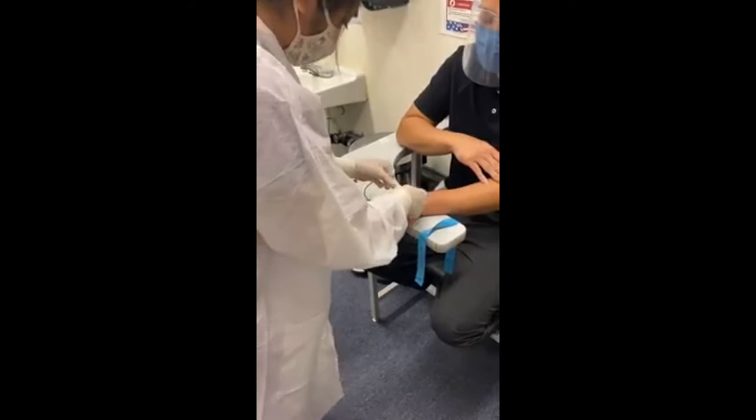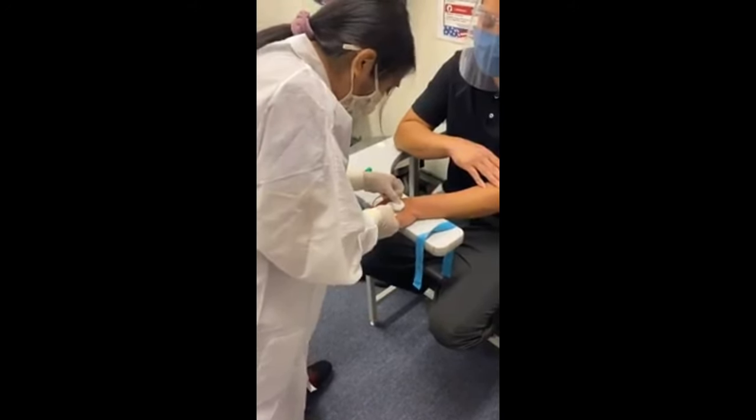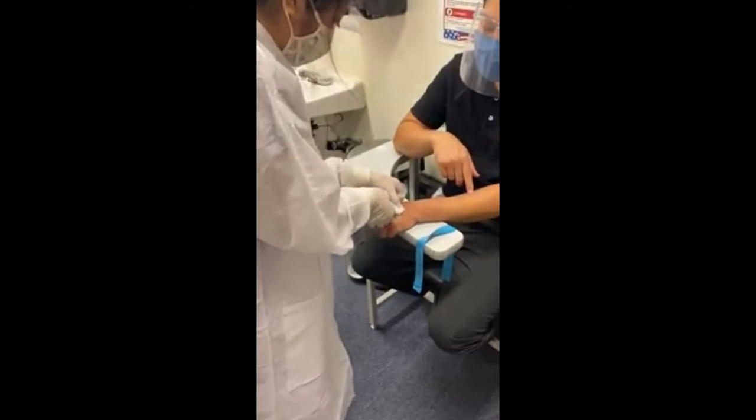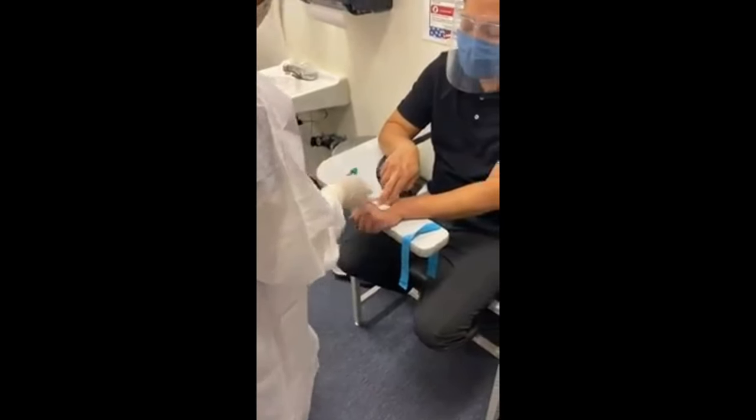Since you guys didn't try that yet, just know how it feels when you press it. Okay, and then you could... There you go. Yeah, so it's like a safety feature. Okay, please apply pressure. Perfect. Okay.